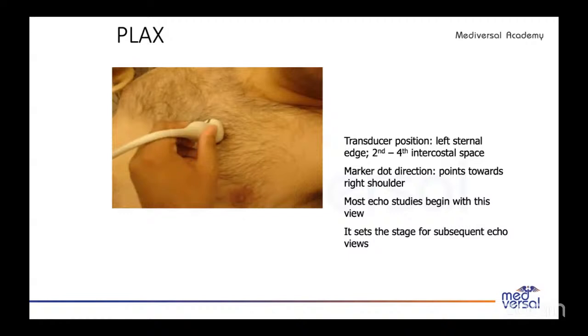Most echo studies begin with this view. So this is the first view, PLAX or the parasternal long axis view. It sets the stage for subsequent echo views. From here, you go to the other views. Next slide, please.